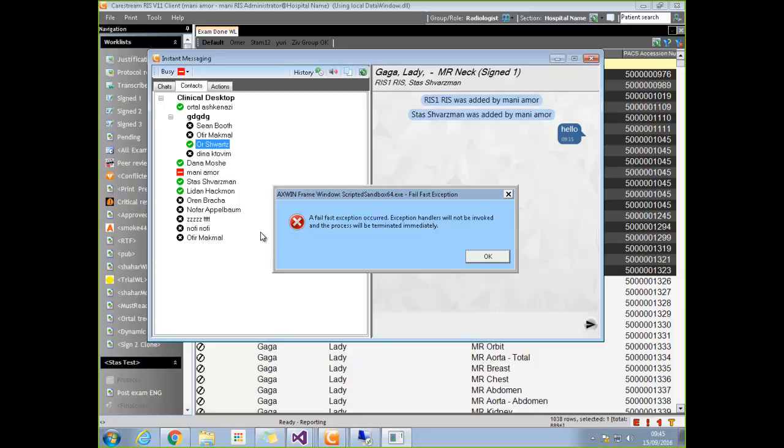But you can't generate a group that says all radiologists or all radiographers or all secretaries should be in this group. Instead of selecting one person at a time, it'd be nice to select a complete group and say, this is a broadcast to you guys. Yeah, but that would go to the broadcast feature. Why? If it's a notification?